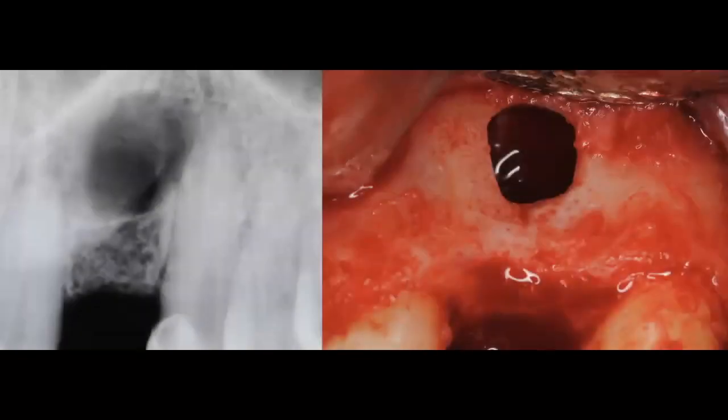So the first thing that we do is that we're going to look at a periapical radiograph. Patient presented in that site a residual cyst, as you can see here on my X-ray on the left. It was a fairly good sized cyst there. So we knew immediately that the first thing that we were going to do is access the site and then remove the cyst and graft this area.